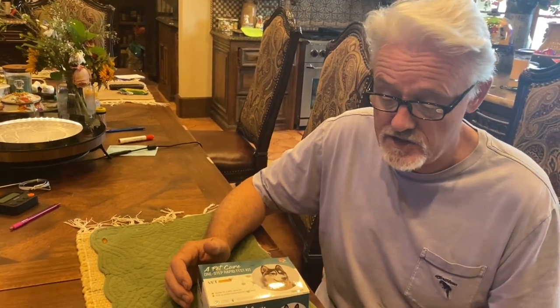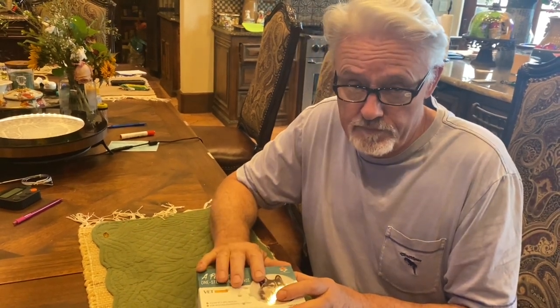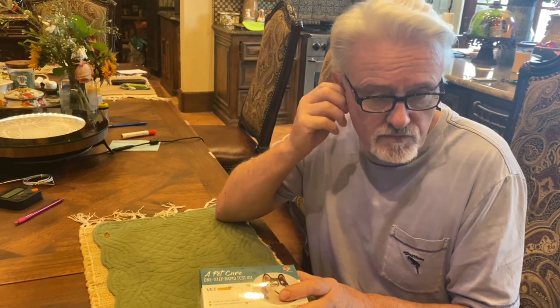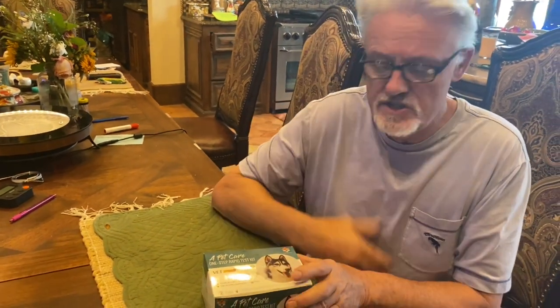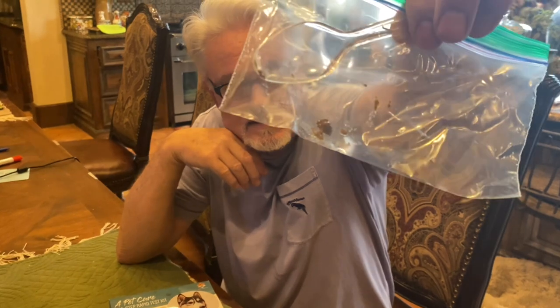A much easier way to do this is to simply do what's called a snap test. This is on a new puppy that we just received — just got him in. He's been with us three days and his stool is just a little soft, so we're going to find out. When they get upset, they can get coccidia, so there's a little bit of poop there that I collected with the spoon.